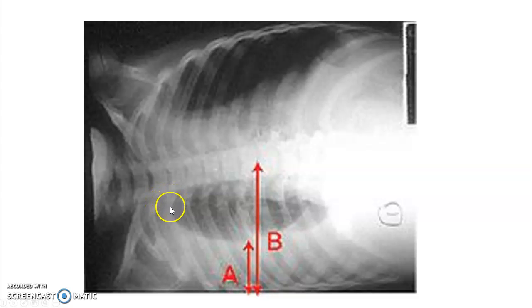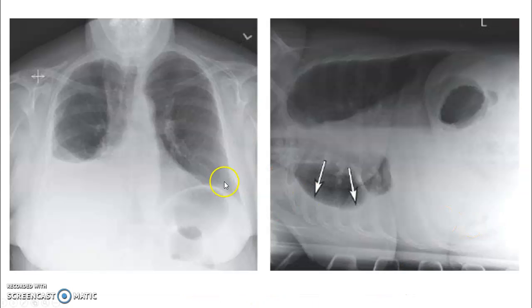This is showing you a good amount of fluid too. Here it's really rounded. This is all white with fluid down at the bottom because the fluid drops. This is a demonstration: this patient was upright, and this is what their lung field looked like. Again, rounded or blunted. You can't see the costophrenic angle like you can on this side.